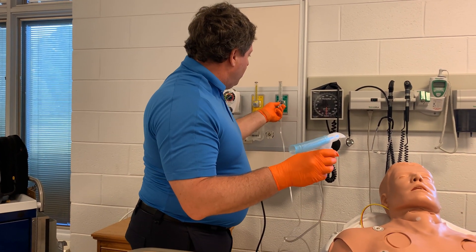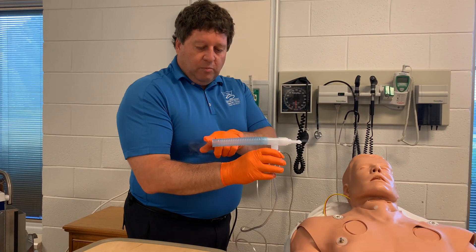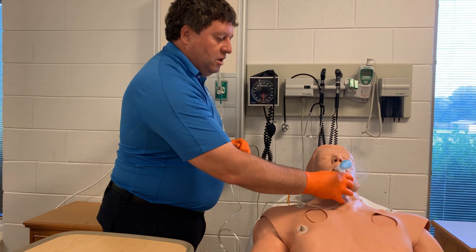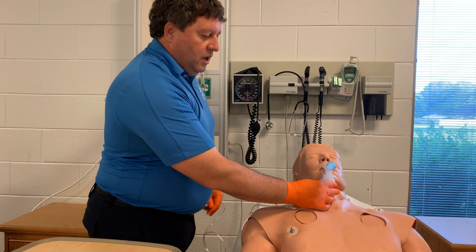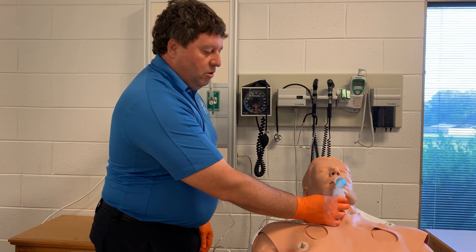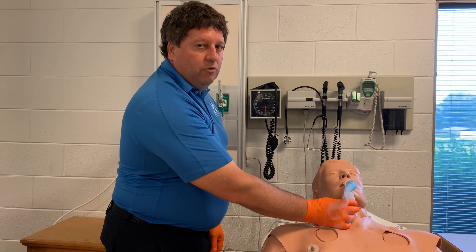At this point I'm going to turn it up to about five. You'll hear it and you'll see that it's beginning to have some mist on each end. Then you will let your patient breathe that in and out until all of it is gone. If you have to hold it then you're stuck there. Hopefully your patient can hold it and you won't have to stay like this for the entire five to ten minutes while it goes through all the medication.